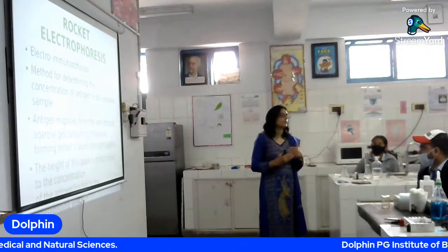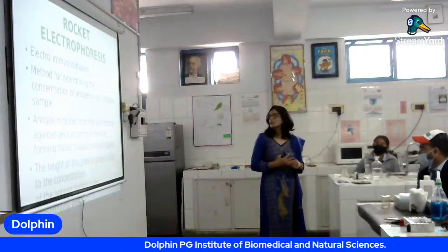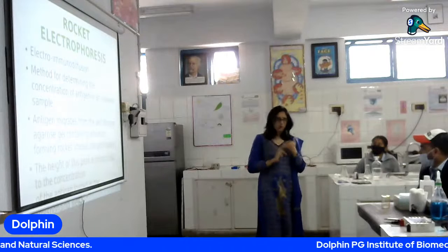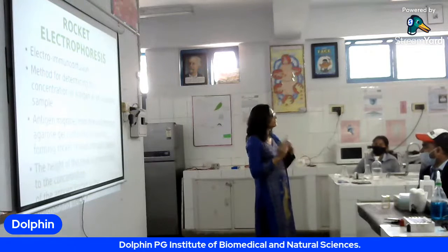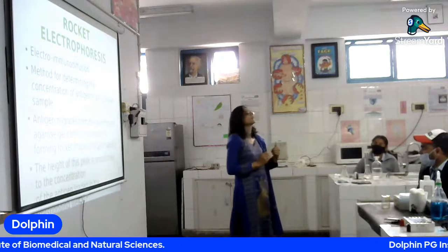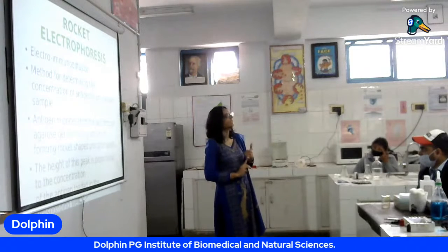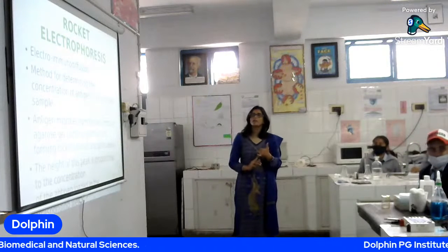So it is better than the immunodiffusion, although there is diffusion भी हो रहा है, but that diffusion is under the electric current. So in this method, it is both qualitative as well as quantitative. Okay, so we can carry this test. We will just see कि हम कैसे इसे quantify भी कर पाएंगे. Very good thing you have suggested कि हम सिर्फ एंटीजन एंटीबॉडी ही नहीं देख रहे हैं, इसके साथ साथ में हम एंटीजन को क्वांटिफाई भी कर सकते हैं. So we can quantify the antigen also in the unknown sample.